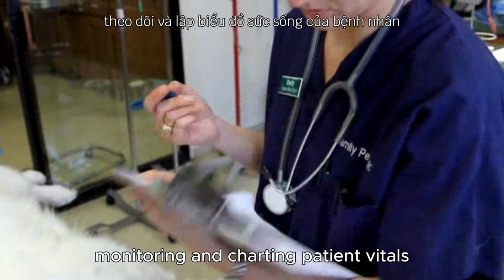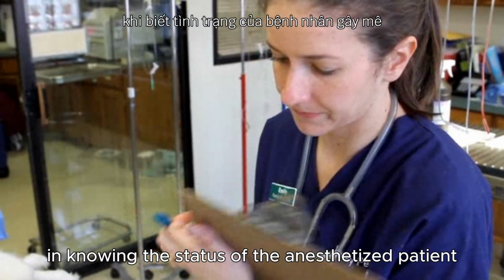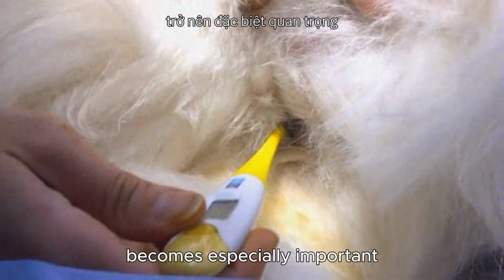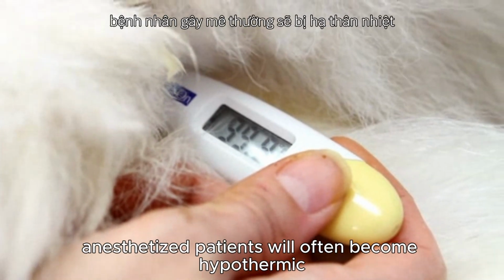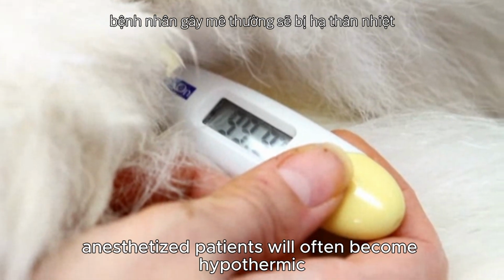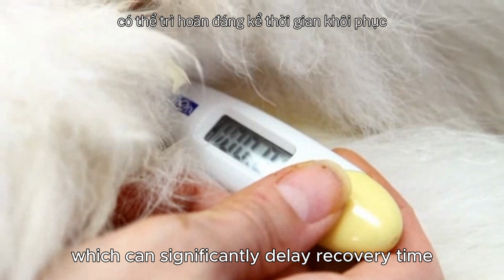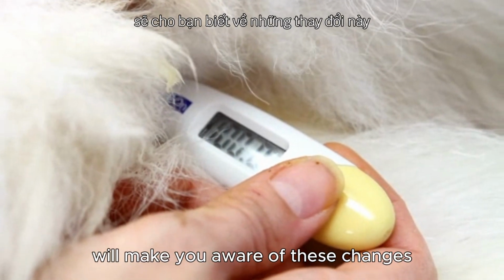Monitoring and charting patient vitals is an important part of assisting the surgeon in knowing the status of the anesthetized patient. Monitoring body core temperature becomes especially important with extended surgical procedures. Anesthetized patients will often become hypothermic or develop a low body core temperature, which can significantly delay recovery time. Taking a rectal temperature will make you aware of these changes.